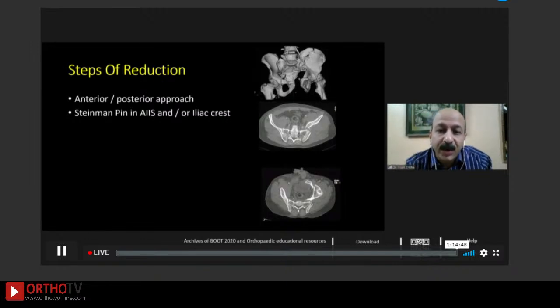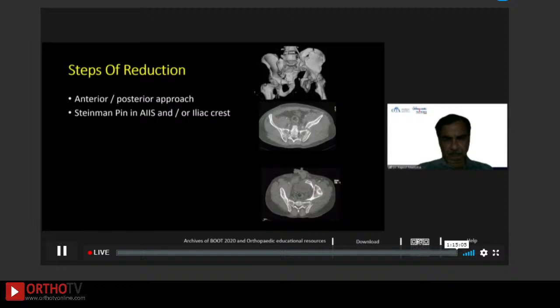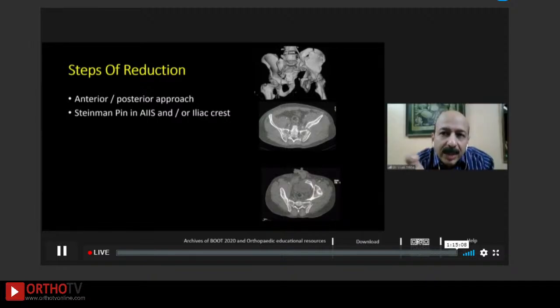the vessels if we have any problems. And we went about fixing that from the anterior side, putting in a Steinmann pin at the inferior spine or the iliac crest and just lifting it up, making sure it is not rubbing the sacral ala. Because if it rubs the sacral ala while reduction, it is going to cause damage. What is crucial is that the ligaments out there, the sacrotuberous or sacrospinous, may not be broken that much. And if they are not broken, if it is an old fracture, to reduce that is going to be very difficult for us.